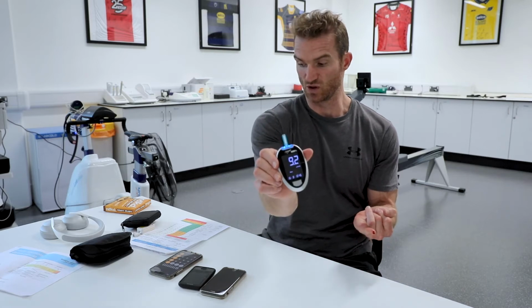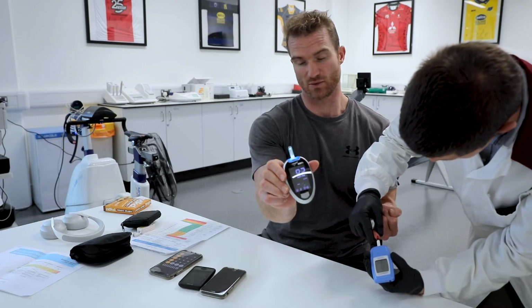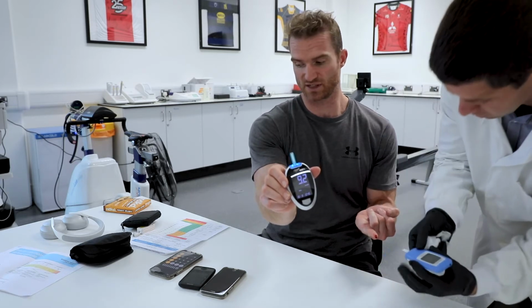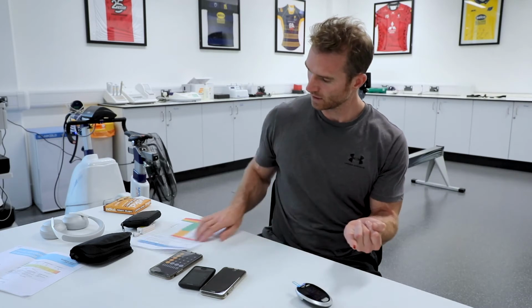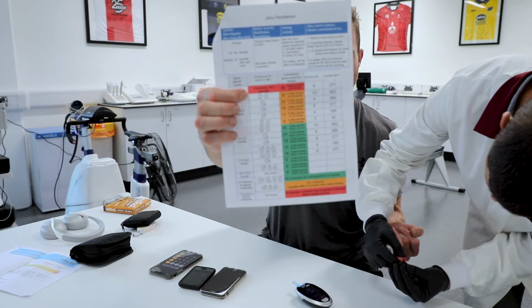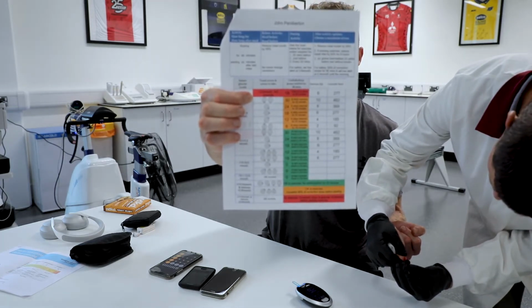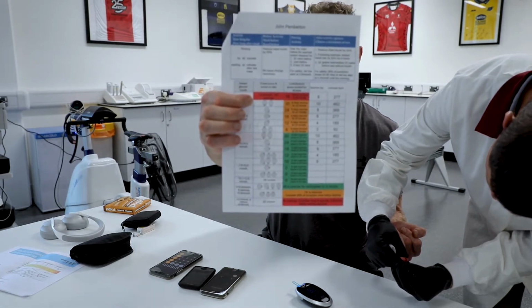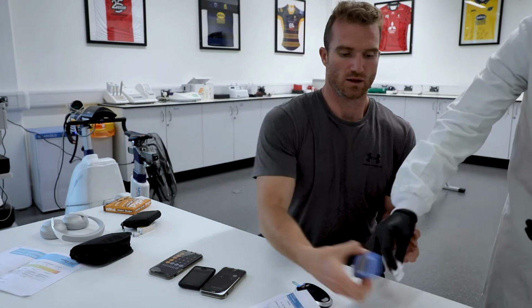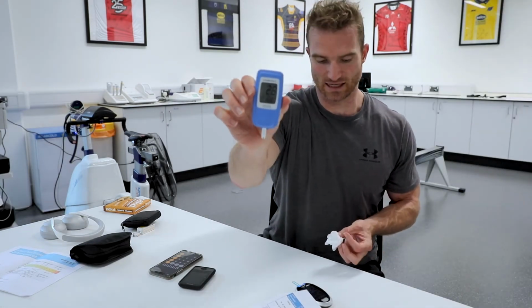So 9.2 on the glucose, so the Sapiens at 9.1 and the Dexcom at 8.3 are both within 15% and trending across. You can see from here, between 7 and 10 with the arrow trending across, no supplementary carbohydrates required for the first 20 minutes. But what we will do is check the glucose 20 minutes in. It may have dropped, it may not, we'll be able to see. The lactate is at 2.8. So we're back almost towards baseline. So obviously the recovery from the previous one has been done.